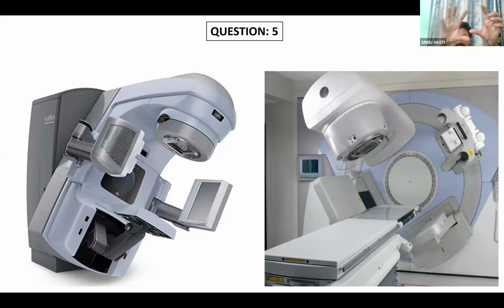Or if it is at one side, like it's almost towards the posterior side, but it is coming towards, sorry, the anterior side. It almost comes to mid level. So on one side he can use 4 MV, on another side he can use 15 MV. So you should know about LINAC specifications. What are the photon energies? What are the electron energies? What are the additional features you have, MLCs particularly, and what imaging modalities you have, whether couch 3D or 6D. So this is very, very important.